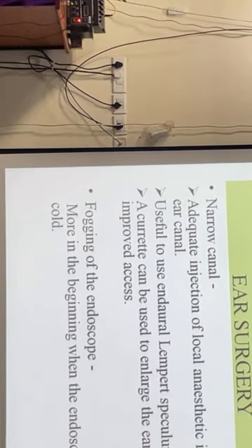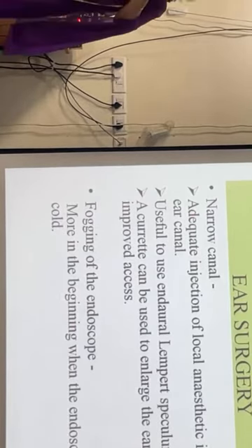So what are the challenges in endoscopic ear surgery? The narrow canal is a challenge.